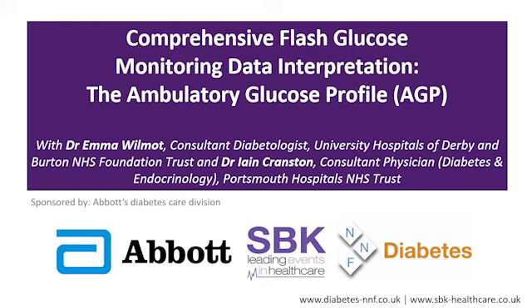What I generally try to encourage people to do is, each time they're changing a sensor, in the hour or so that they haven't got any data, if they're in front of a computer, have a look and say, okay, I'm about to start a new sensor. In my next sensor, do I want it to look exactly the same as the last sensor?